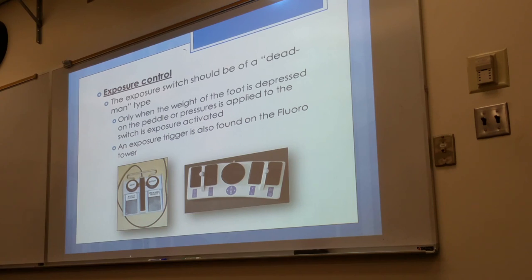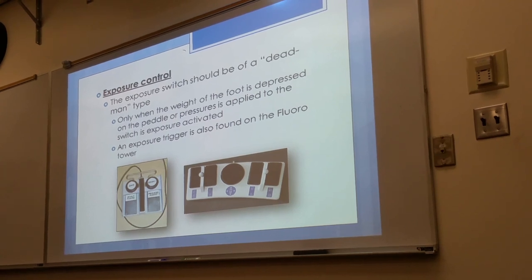Now, quick question, guys. Are you guys allowed to operate the fluoroscopic unit? No. Why not? Okay, let's just say you get your fluoroscopy certification.